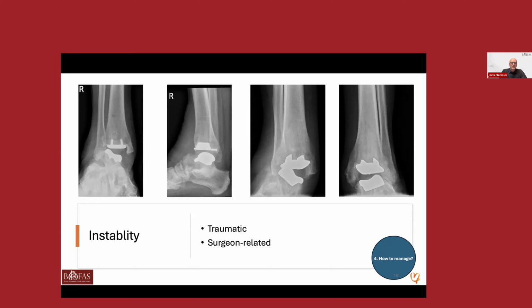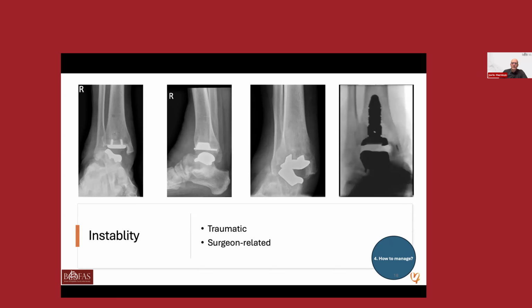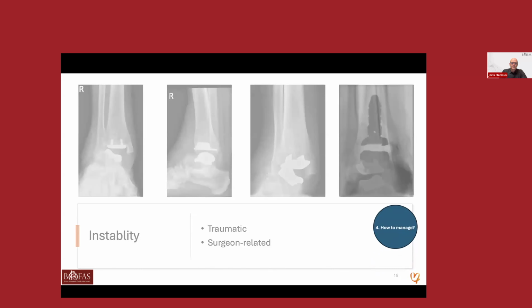Besides that, you see, like already mentioned by Kris, there is also a slight valgus of the foot, so there's more to balance. Nonetheless, I revised it and I reinserted the deltoid ligament, addressed the pes planus, and performed an internal brace locally.